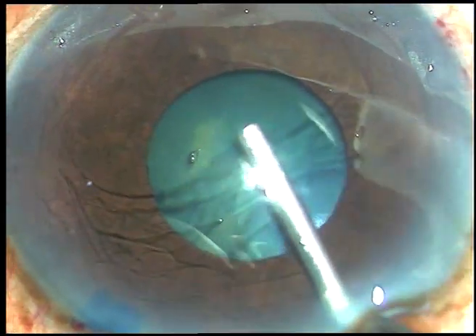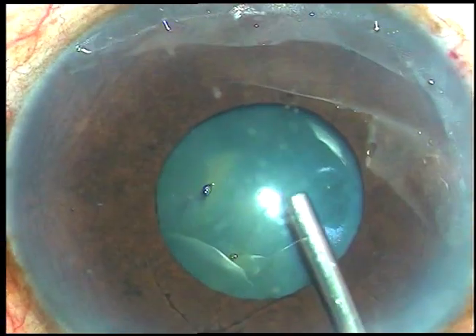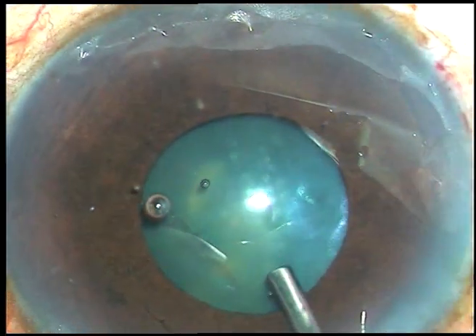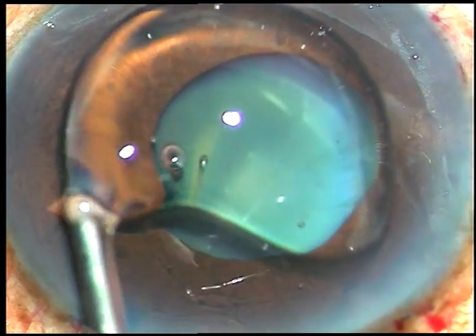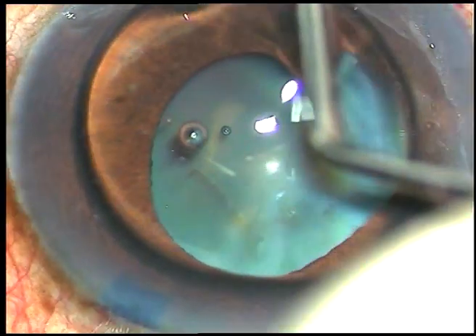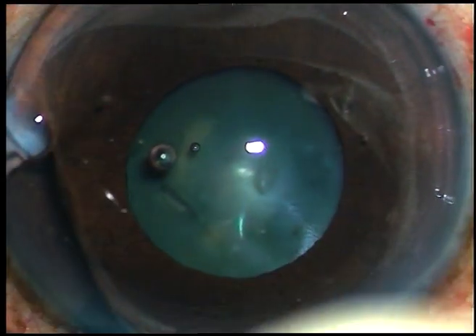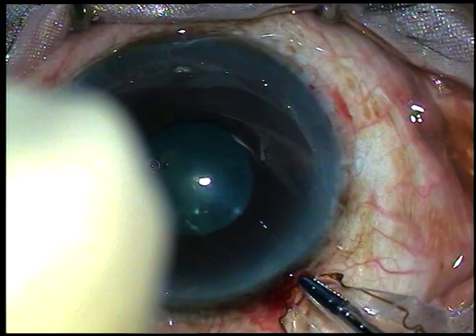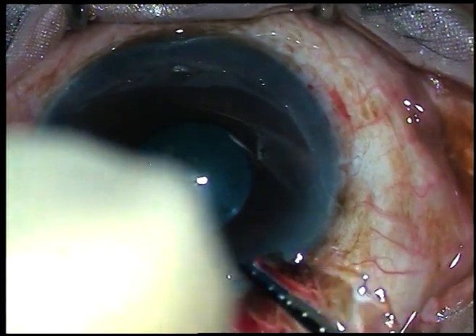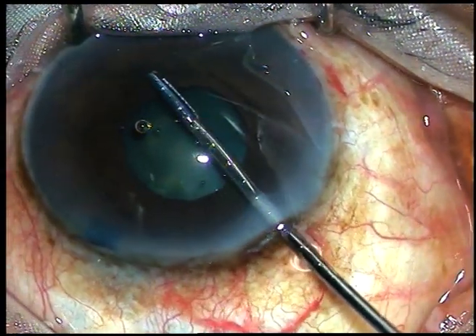Friends, I am going to show three cases of B-hex. This is the first case. The capsule has been stained. Viscoelastic substance is being injected into the anterior chamber and a little bit underneath the iris. A little bit of viscoelastic substance is sprayed over the corneal epithelium for better visibility. Now this is the B-hex pupil expander. Make sure that it goes into the anterior chamber completely.